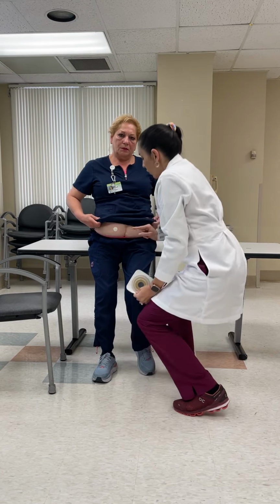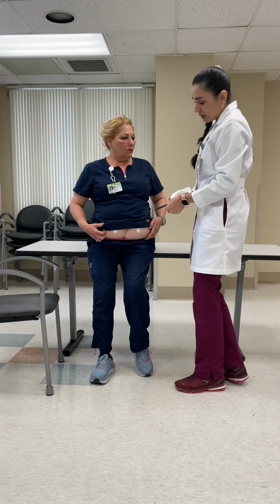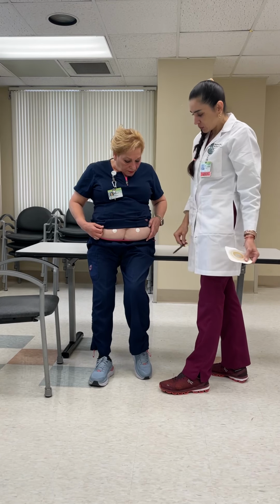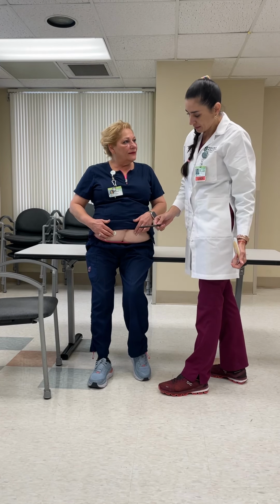But it's also important that we explain to the patient to point, because it has to be a visible area for the patient. So are you able to localize where your stoma is? Yes. Can you touch it with your finger? Yeah, and the other side? Yes. Also.